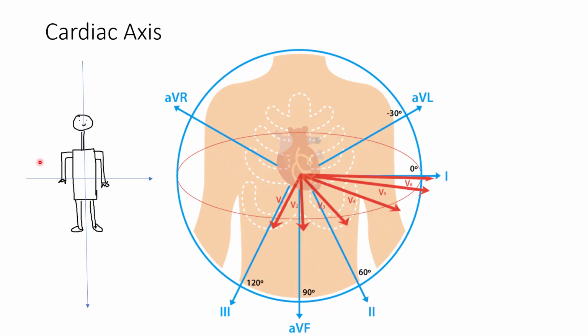so that we can interpret ECG quickly and correctly. In ECG, we should make sure that lead placement is correct, all leads are placed in the correct place, and the patient is in a perfect anatomical position. These things.